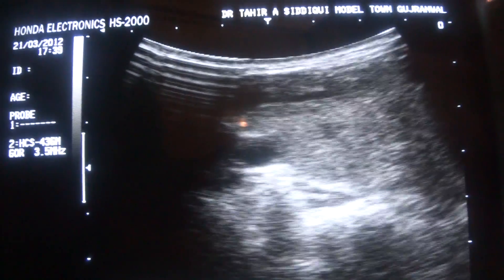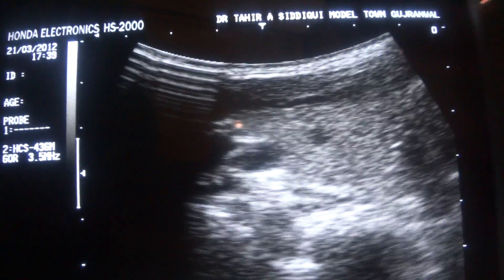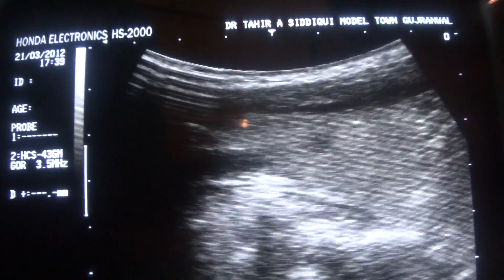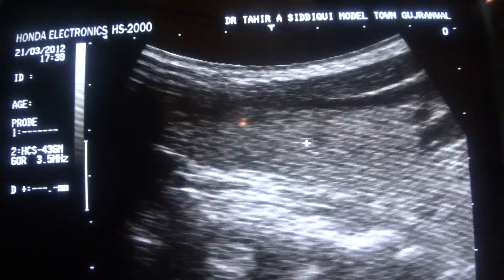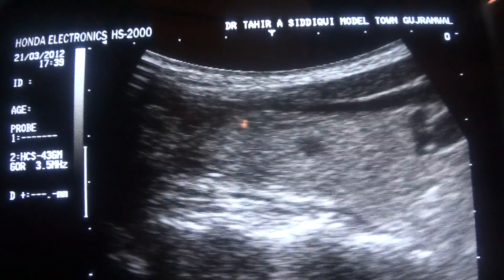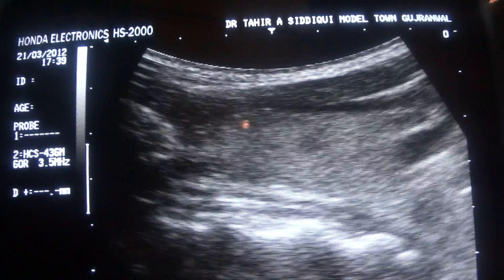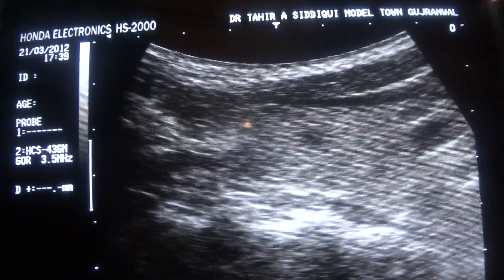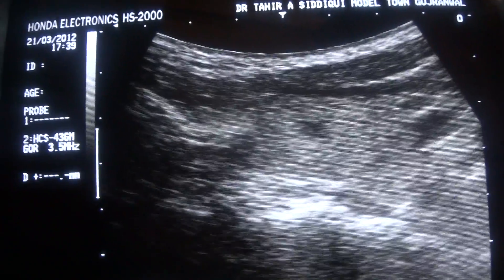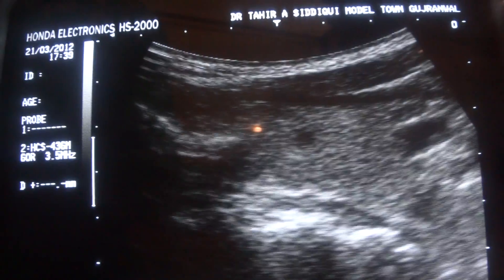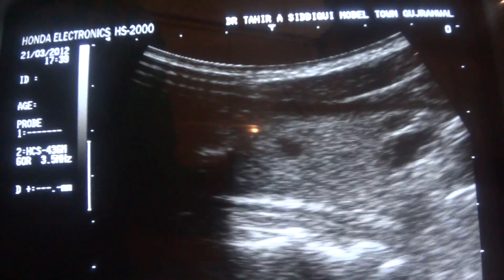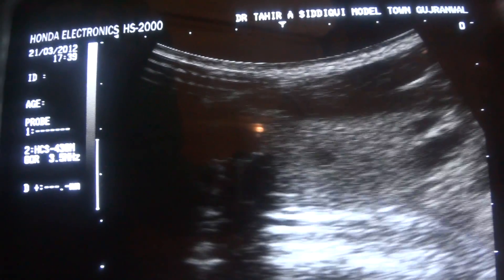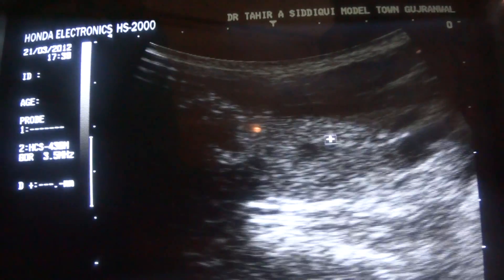This is in fact the parathyroid gland. I will first focus the area — try to keep it in the center — and rotate the probe 90 degrees. It remains there; it does not change shape, and remains rounded and hypoechoic. This is in fact the parathyroid gland in longitudinal section.